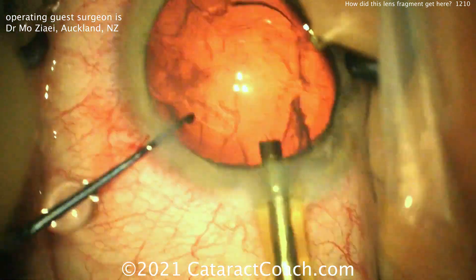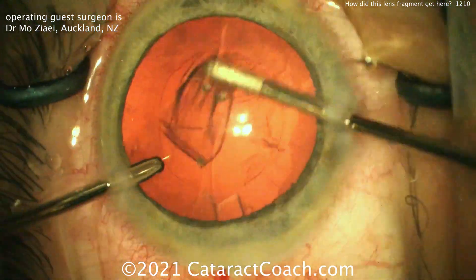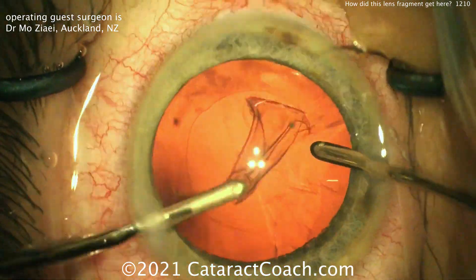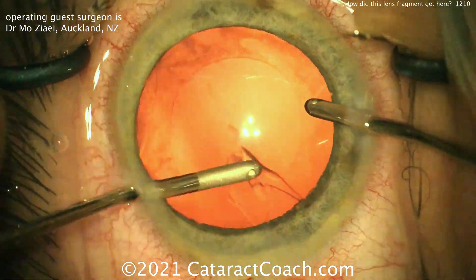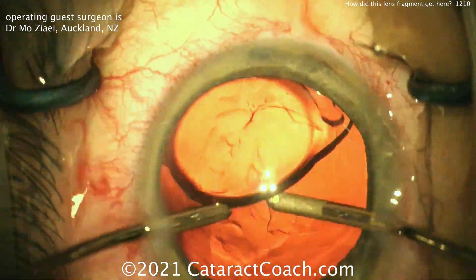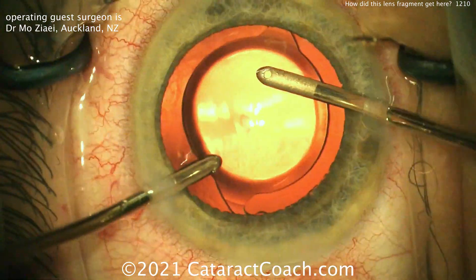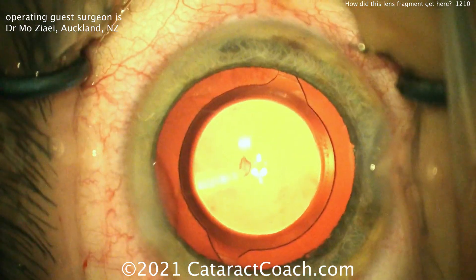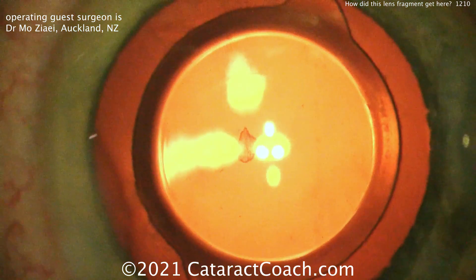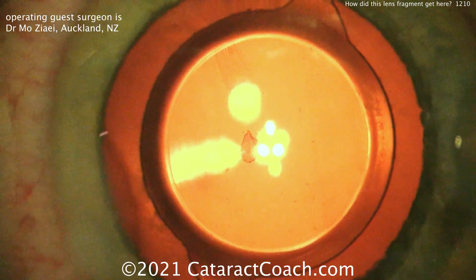What ends up happening is we fractionate the cataract into tiny little pieces, and they swirl around the eye so many times because we're using all this infusion — the flow rate, how many times you turn over the anterior chamber — and a tiny little bit of the cataract material can go through these zonular fibers and end up behind the posterior capsule. You can see here, in this case, one particularly large piece right in the dead center. You can't get this without opening the posterior capsule, or maybe even going through the vitreous cavity or through pars plana.